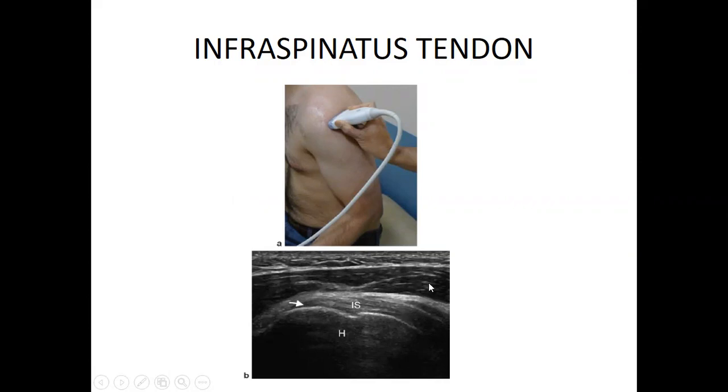Again, this is our deltoid muscle. This is our infraspinatus tendon. It's not a muscle, this one. It's a tendon now. It's coming from somewhere. Where? The posterior portion of the scapula. They are all coming to insert. The key thing is they can only be demonstrated when the patient is in a certain position.